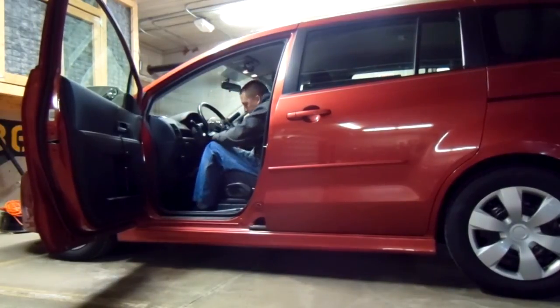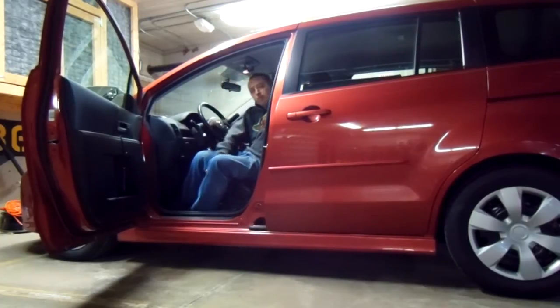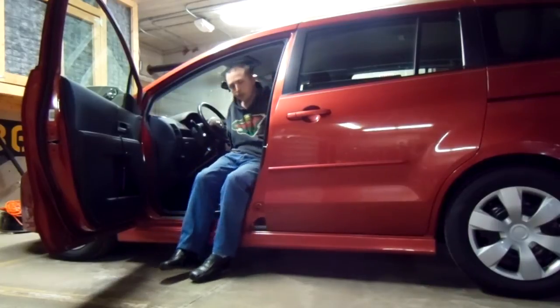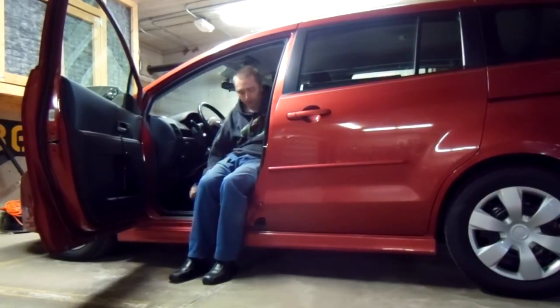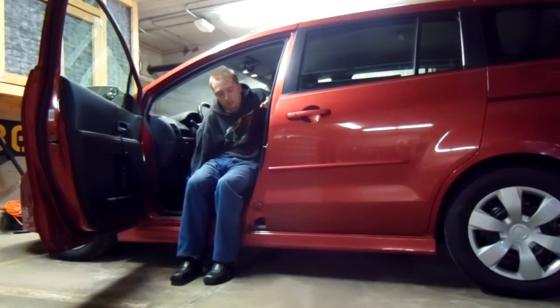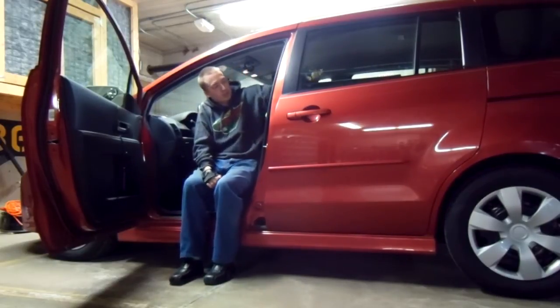First step: slide the seat back. Straighten legs to go under the hand controls. The Mazda 5 is not quite as roomy as a regular minivan, but for a pretty average height guy — about 5'10" — there's enough room. If I were a lot taller I'd probably look for other vehicles.